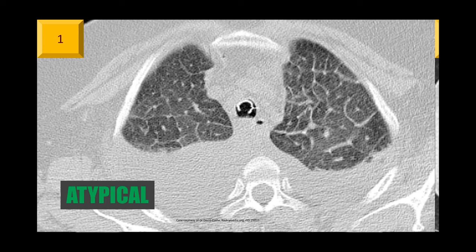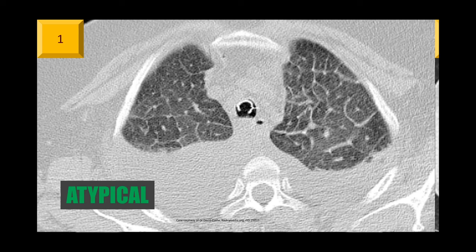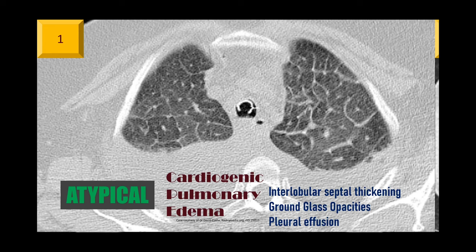we should classify the first patient with atypical findings, because he has cardiogenic pulmonary edema, represented by interlobular septal thickening, minimal ground glass opacities, but he has pleural effusion as well. This is an atypical appearance for COVID-19. In another video, we're going to talk about the recommendations to the reports of COVID-19.